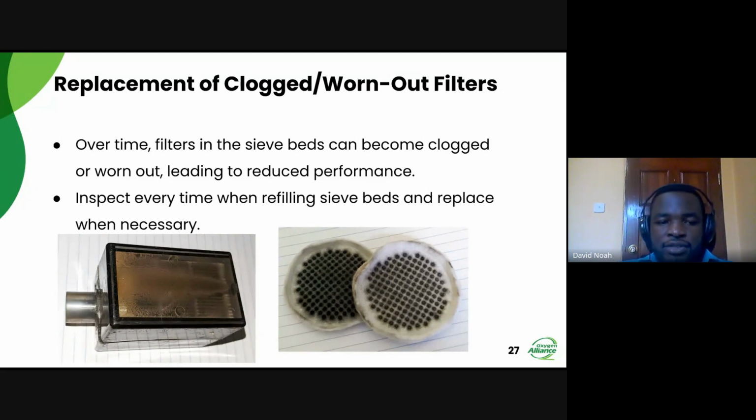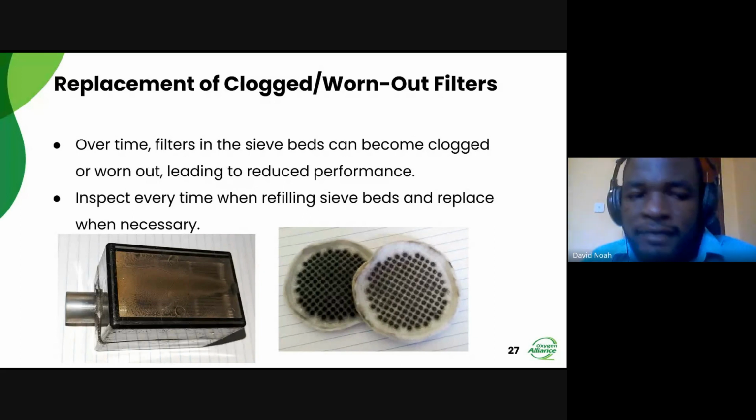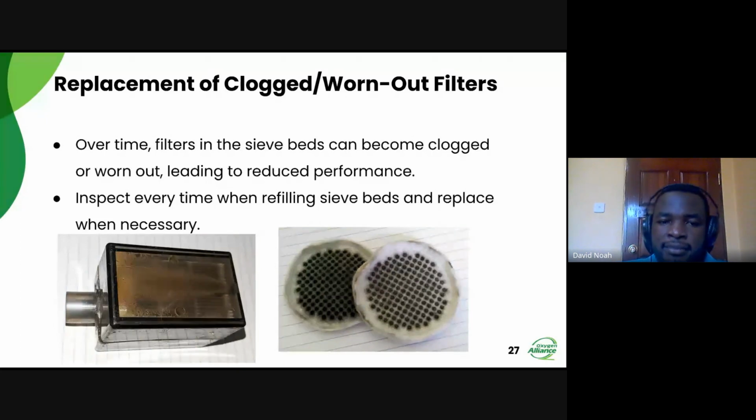Regular replacement ensures that the filters remain clean, allowing for optimal airflow and gas separation within the sieve beds. By promptly replacing the worn-out or crushed filters, the risk of concentrator malfunction and failure is minimized, reducing downtime and ensuring uninterrupted oxygen production for users.